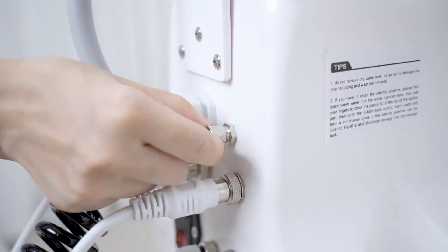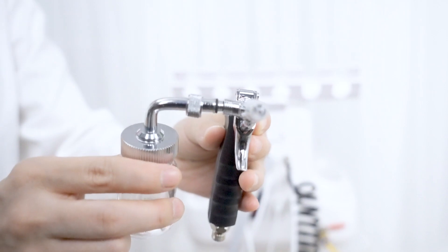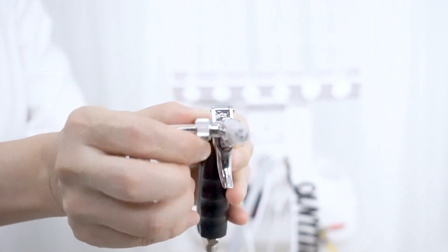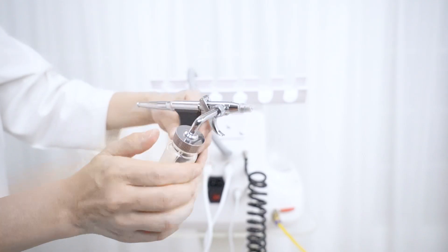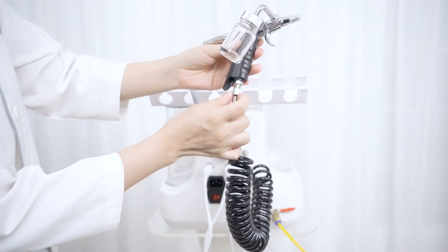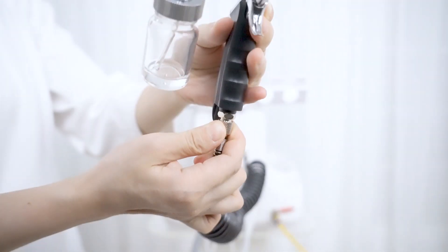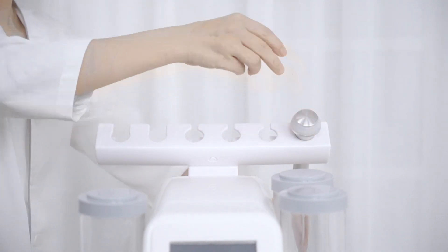Tighten the screw. Connect the hydro bottle with the handle and tighten the screw. Connect the hydro spray handle with the other end of the handle and tighten the screw. Place the handles onto the handle holder.